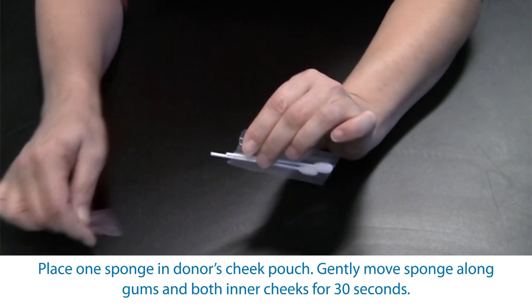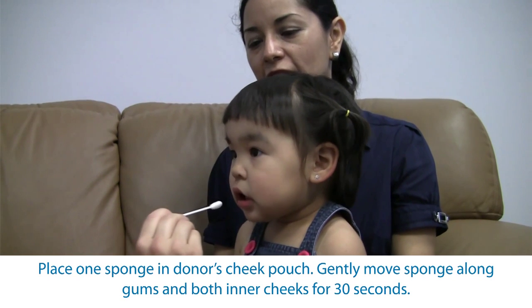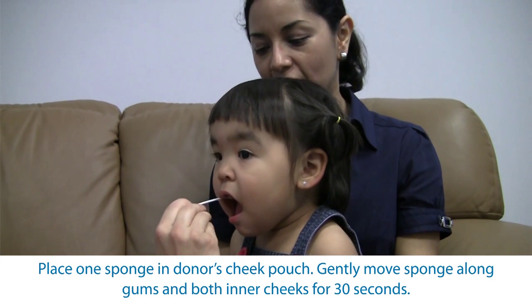To begin, tear open the bag containing the sponges at the notch and remove one sponge. Place the sponge in your child's cheek pouch.